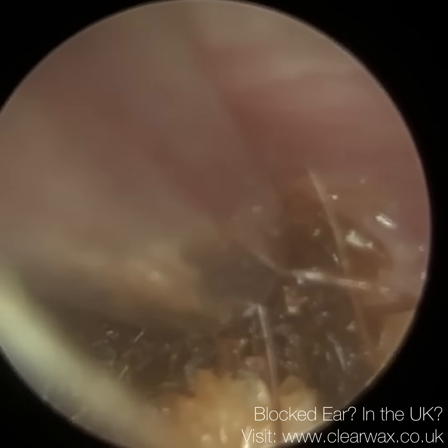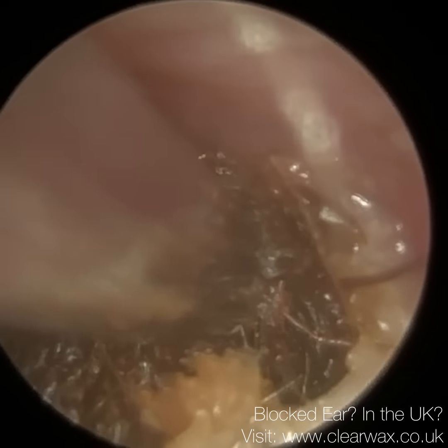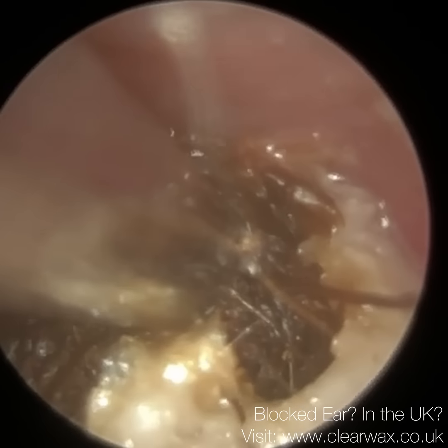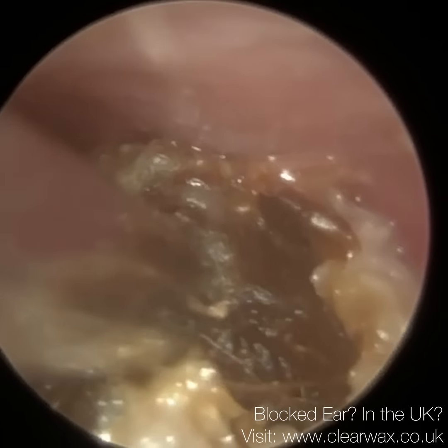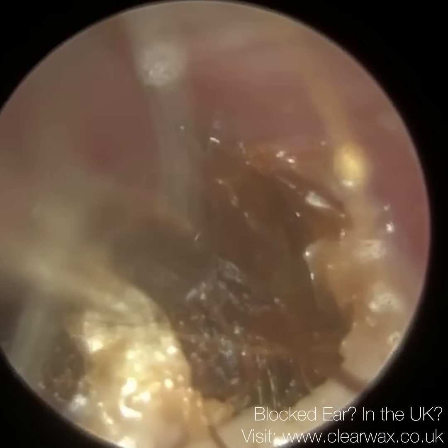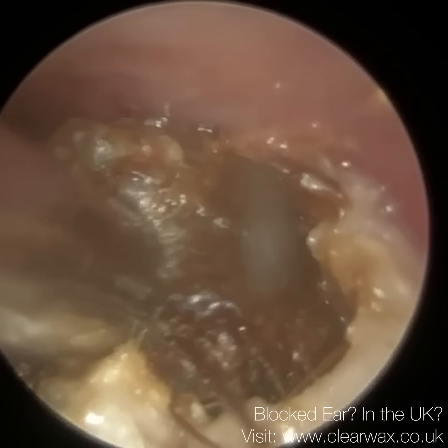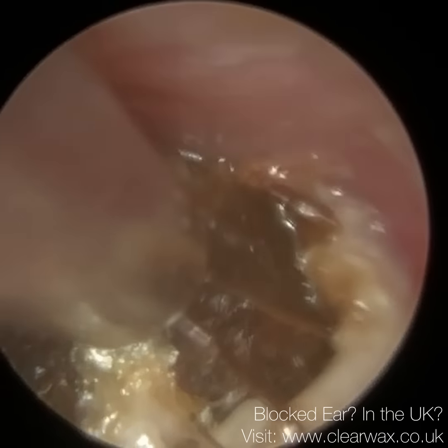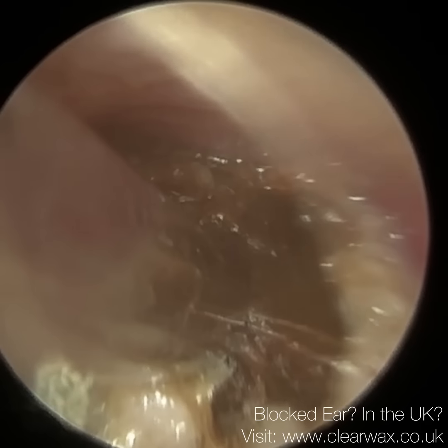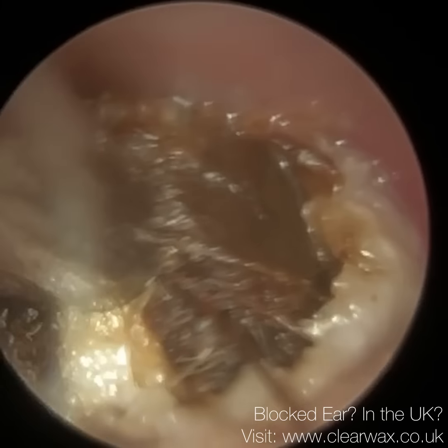And it's quite typical of a keratosis obturans. It's not a quick procedure. I always compare it to the game Jenga. It's when you remove one piece and it all then starts to crumble away, but to remove that one piece, it does take a while. So this plug, it's going to detach itself from the outside silvery matrix. So I'll have to go back in a bit later and remove that white layer, because that's going to remain in the ear canal, but this plug is now coming away.